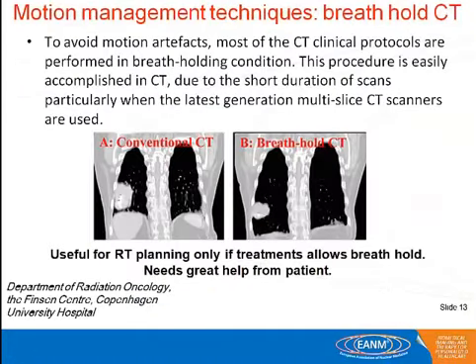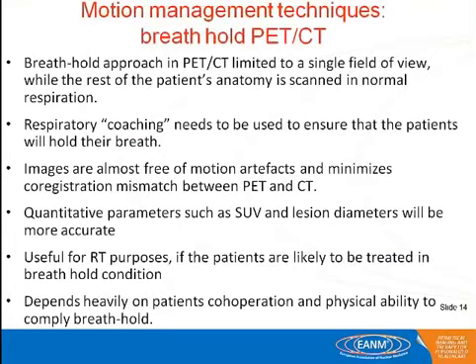What can we do? There are some types of excursion management. This is the breath-hold CT. The procedure was used mainly for CT, with a breath-hold. In RT planning it is helpful only if the treatment is short enough to allow breath-holds. Otherwise, it's unusual for us and needs really great help from the patients.